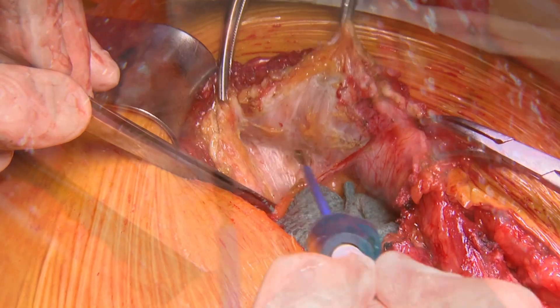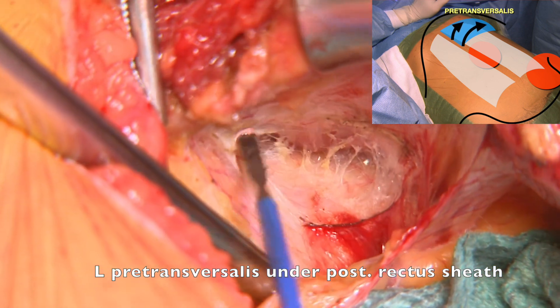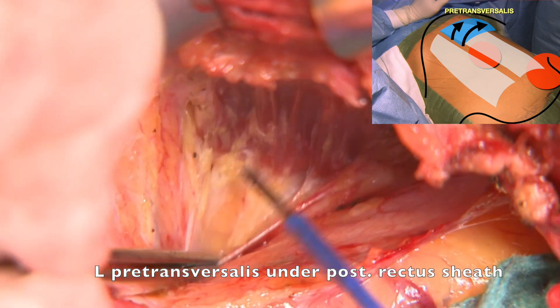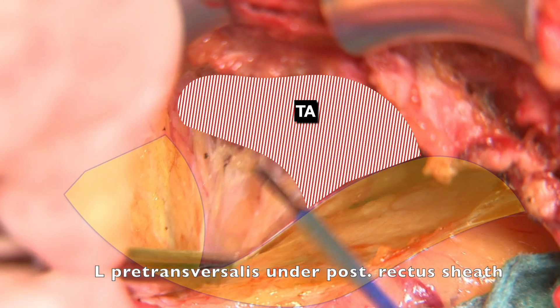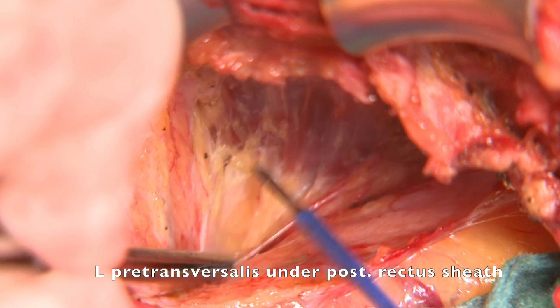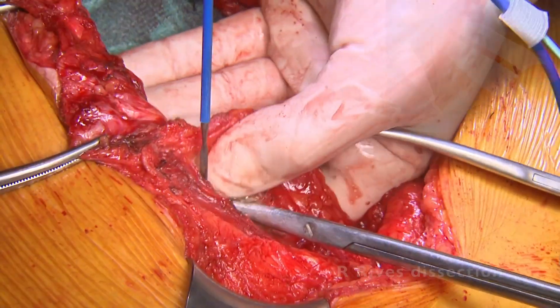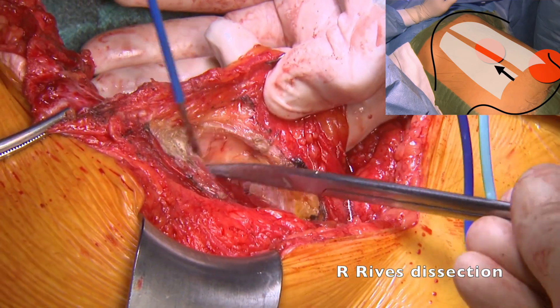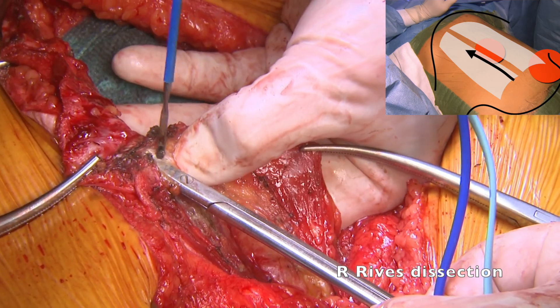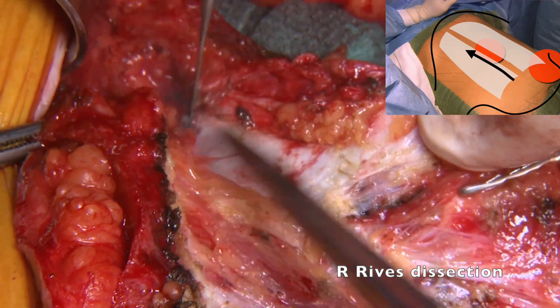During the first 2 or 3 cm from midline we can walk completely preperitoneal, but we change to a pre-transversalis plane more laterally as it is easier to injure the peritoneum at this area. We reach the pre-transversalis dissection without injuring the posterior rectus sheath or the transversus abdominis muscle. We also make the retromuscular dissection on the right side. It is important to incise the posterior rectus sheath under the linea alba as close to the midline as possible, to get the most of both anterior and posterior rectus sheaths.